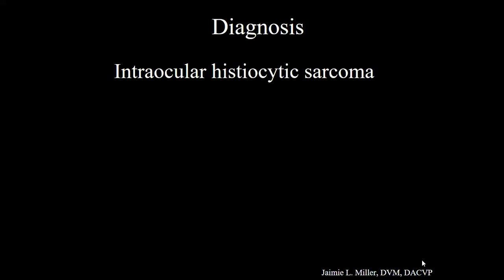Did you mention the carpeting behavior in this one? Yeah, the carpeting behavior is often something that we see with metastatic disease of neoplasia to the eye. So maybe that makes it a little bit more likely that it's metastatic in this case, instead of forming a big mass-like lesion in the globe. So, yep, I think that is it for me.